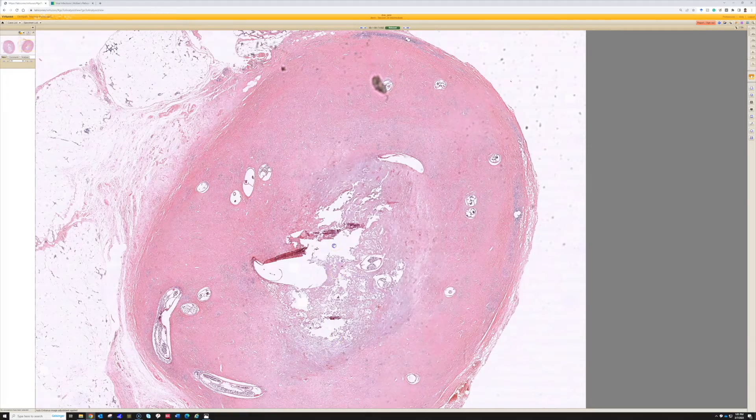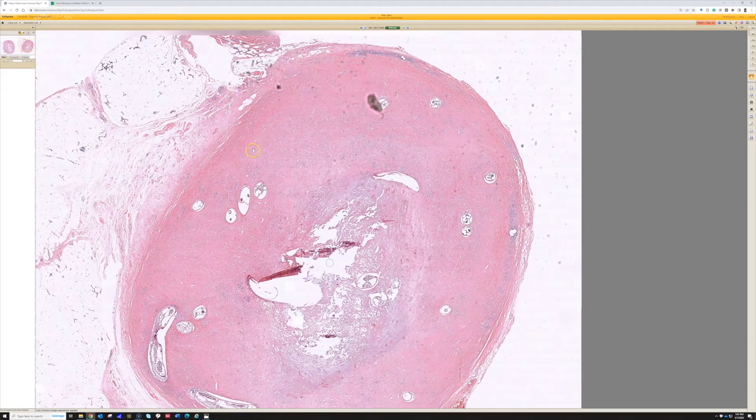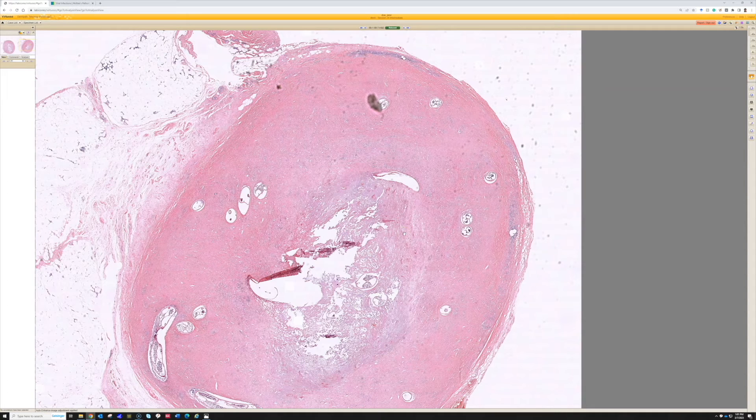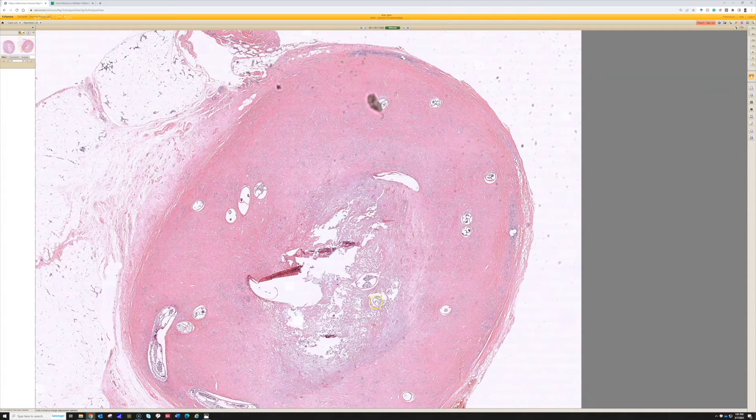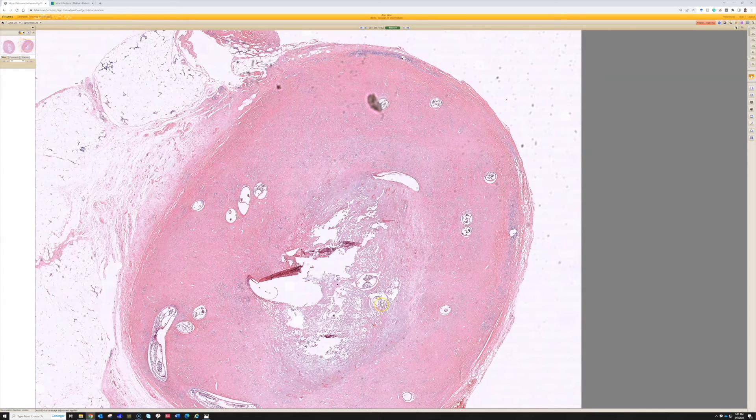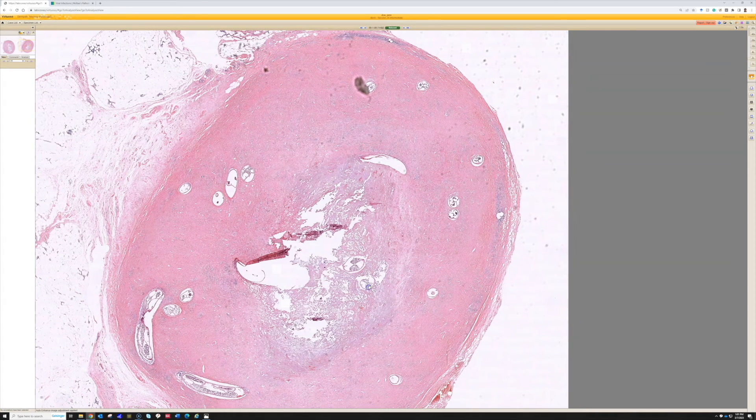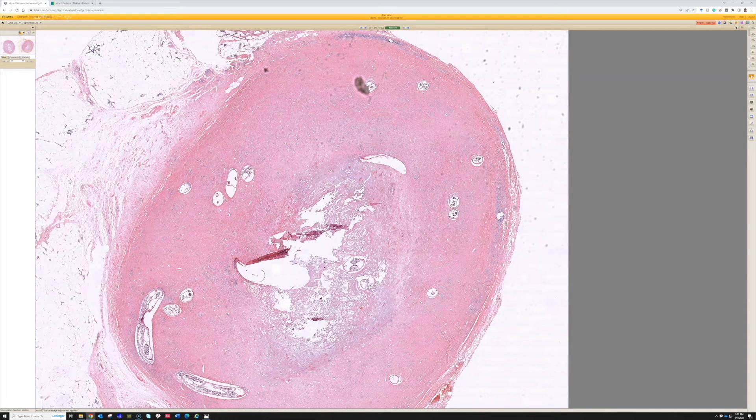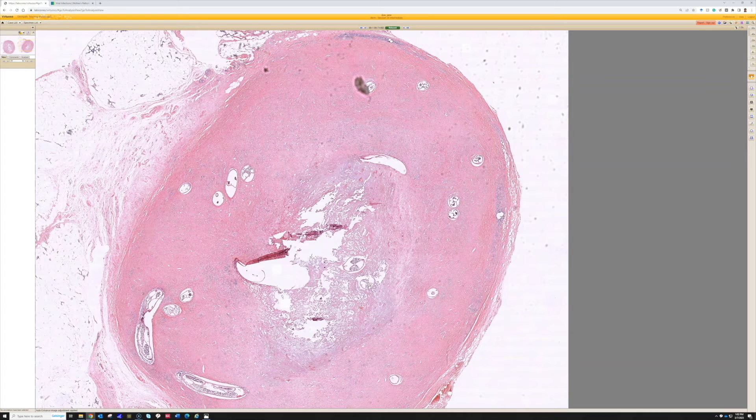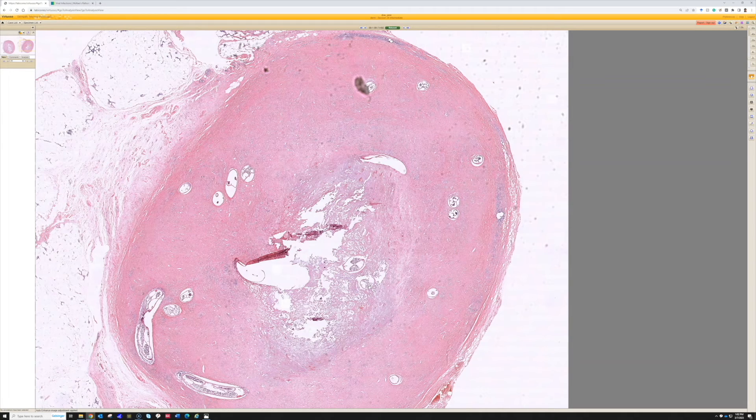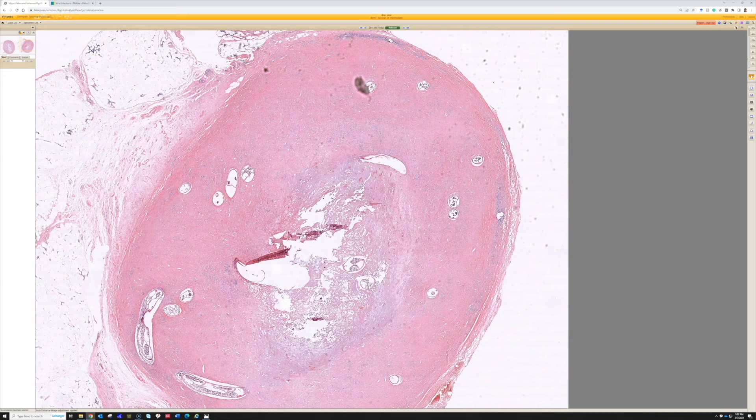Oh, and I would have one other point. If you see something similar to this and you're, say, in North America and the patient has no travel history, and you might see some degenerated area that looks a little bit like a worm. Dirofilaria, the dog heartworm, can sometimes infect humans, although my understanding is it cannot live long-term in humans. So in humans, it does not cause heart infection, but instead the worm gets into the skin or subcutis, or sometimes the lung, and then dies and the body cases it off.